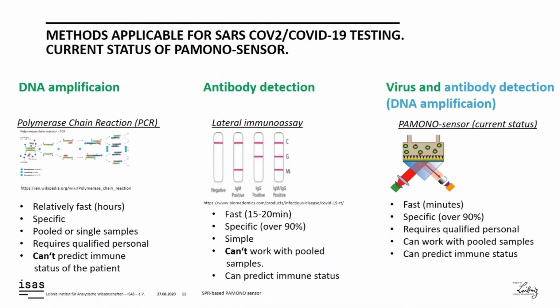The PAMONO-sensor can detect viral particles by themselves and also can detect antibodies against viruses. In the next slide, I will explain how this can be done.